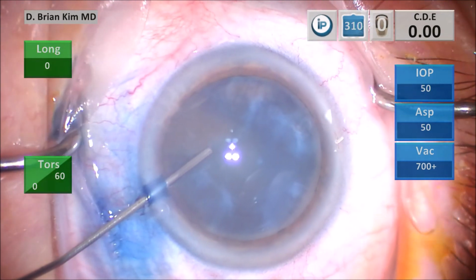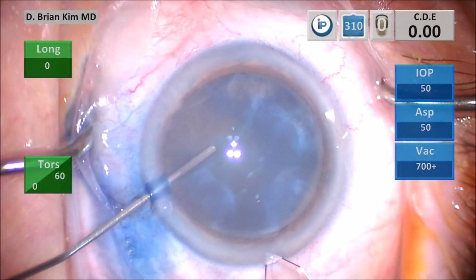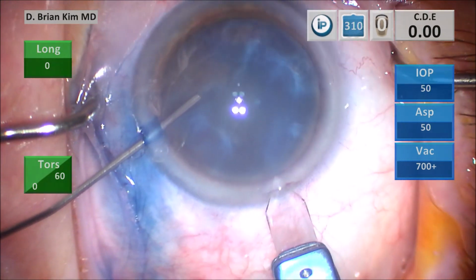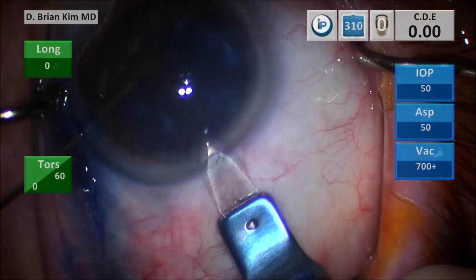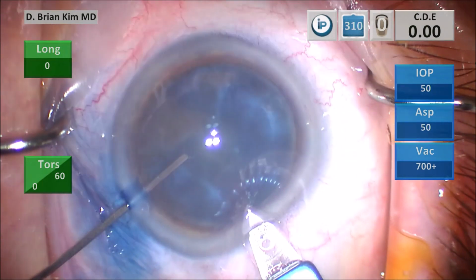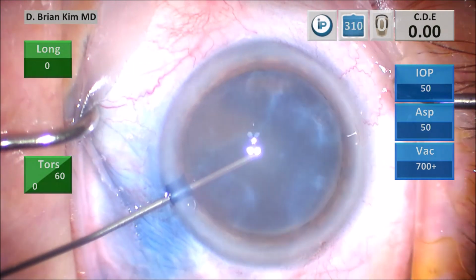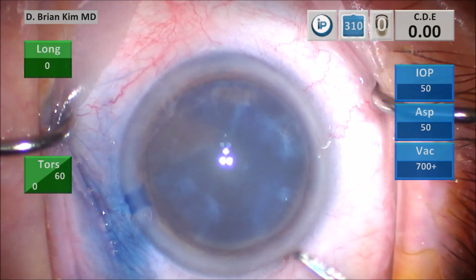And this is a triplanar corneal incision using the cannula to hold the eye. I make a vertical groove, place the blade into the deep part of the groove, tunnel through the cornea, controlling the eye with the cannula, turning the eye towards me, and then entering. Pushing some more viscoelastic after that to inflate the anterior chamber.